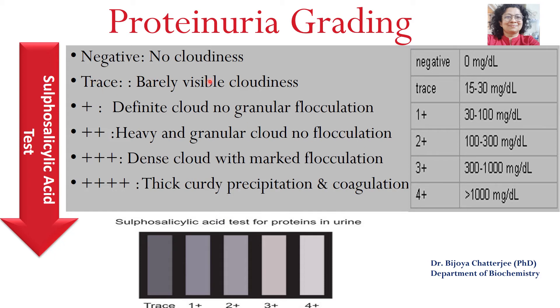When there is no cloudiness or no precipitate after performing the sulfosalicylic acid test, proteinuria is absent — 0 milligrams per deciliter. If there is barely visible cloudiness, as shown in this plate, it is present in traces, meaning 15 to 30 milligrams per deciliter.